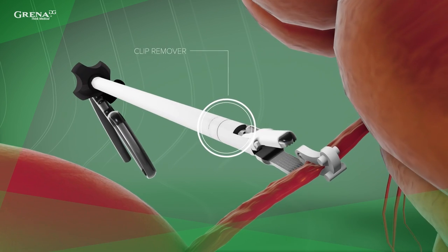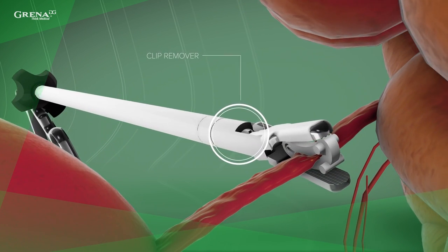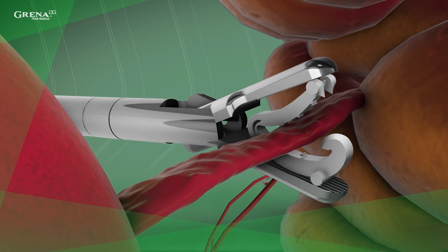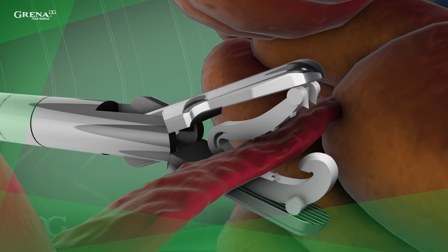Slight compression on the applier handles may also be necessary during applier withdrawal from the trocar. To remove the clip, choose the appropriate clip remover. Don't use excessive force to unlock the clip. You must remember that clips cannot be reused, even if there is no visible damage to the clip.